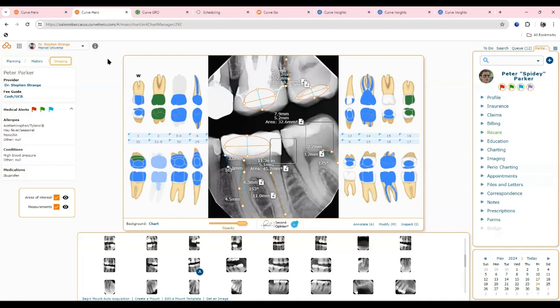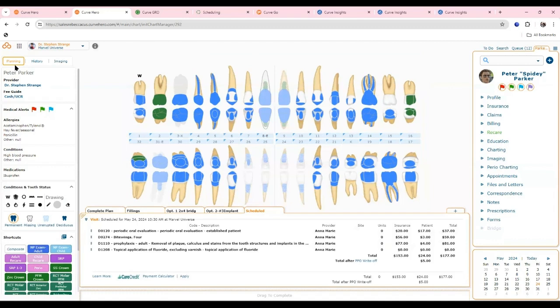AI caries detection really helps dentists make sure they don't miss anything. It's also great for insurance documentation — many practices are sending that information in with their insurance claims to have that extra documentation to help get claims paid. In the planning area, we can organize treatment plans and add plans for patients.